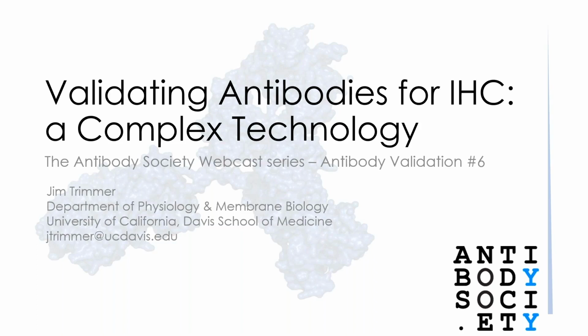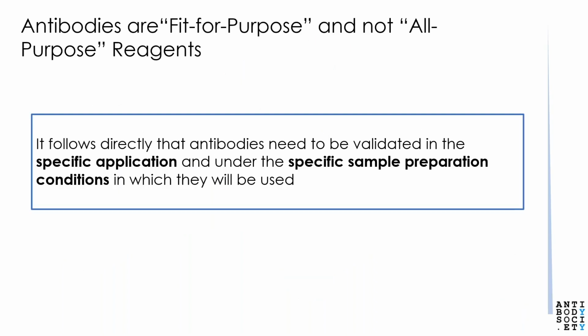Thank you, Simon. Yes, today I'll be discussing validating antibodies for immunohistochemistry, a widely used application for which antibody validation has unique challenges, but which also offers unique opportunities for effective antibody validation. Antibody validation for IHC falls under the same basic consideration as for validation in other applications. First and foremost is that antibodies should be considered fit for purpose and not all-purpose reagents.